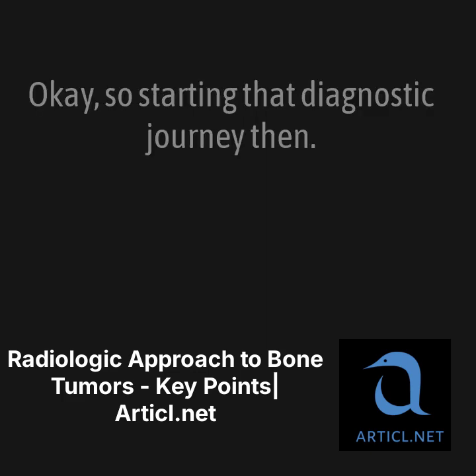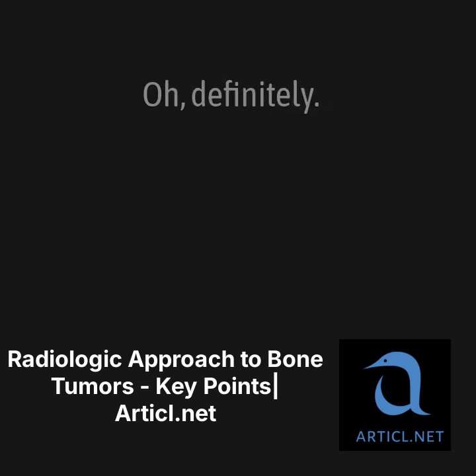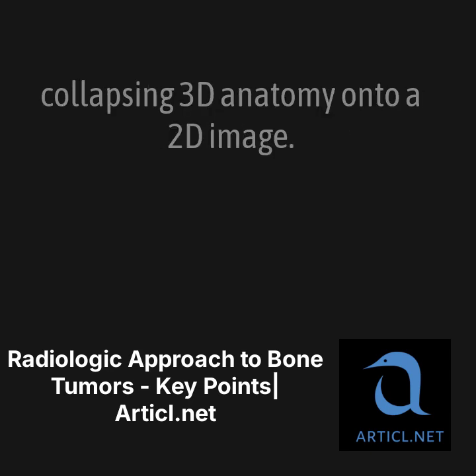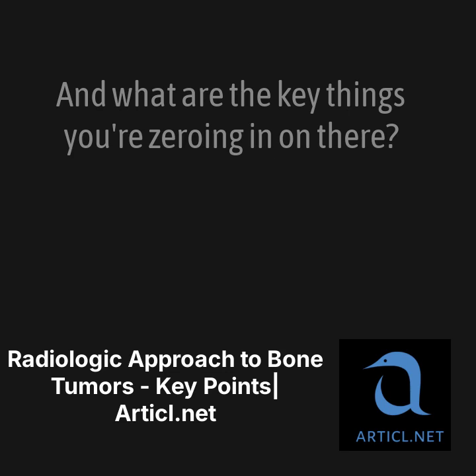Okay, so starting that diagnostic journey then. Plain radiography still feels like the first port of call for most, right? Yeah, still the cornerstone. Definitely. It's affordable, accessible, and it does this unique thing, collapsing 3D anatomy onto a 2D image. It's great for that initial triage. And what are the key things you're zeroing in on there?